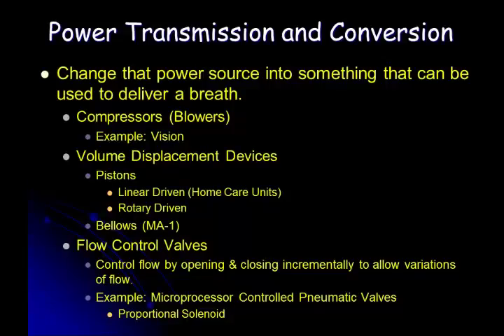But there's a bellows internal to that. Same bellows like you would have in a fireplace. Same kind of idea. Okay. Most of the ones that we're going to encounter, though, are some kind of a flow-controlled valve. There's something electronically that is opening and closing, whether it's like a shutter on a camera or a pair of scissors-like valves that opens and closes to allow gas flow, or some other mechanism. There's got to be something electrically causing that flow to be altered.